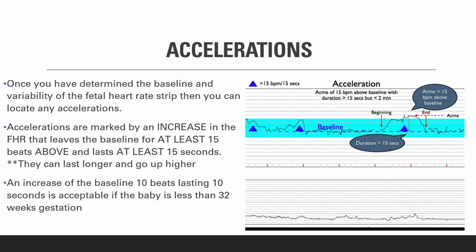You can see here the baseline, and of course there are no numbers because I don't know what number the baseline is. But as the baby's baseline starts to rise, which is the beginning of the acceleration, it goes up, let's just say, I believe that is 110. So a baseline of 110 going all the way up to 160, and then going above 160 to about 170, and then it ends back down to the baseline.